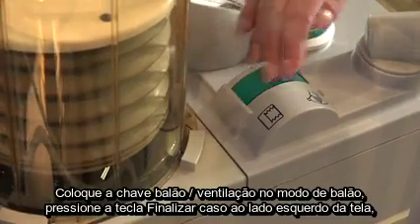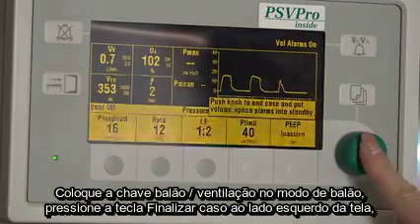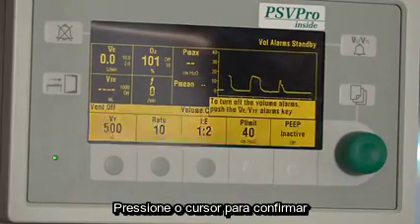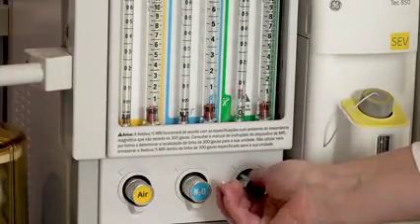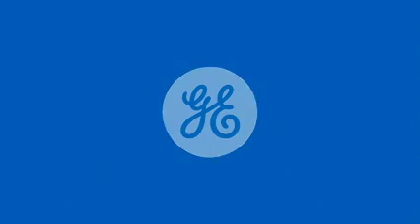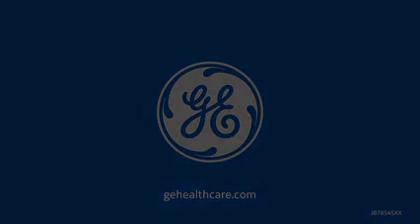Move the bag-to-vent switch to bag mode. Press the End Case key on the left side of the display and press the comm wheel to confirm. Turn off gas flows.